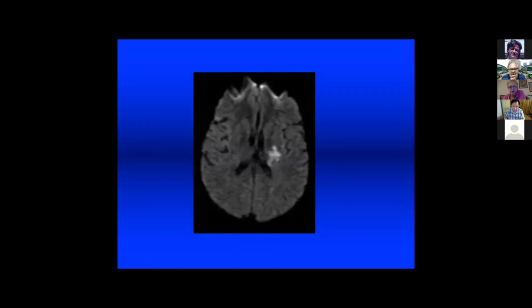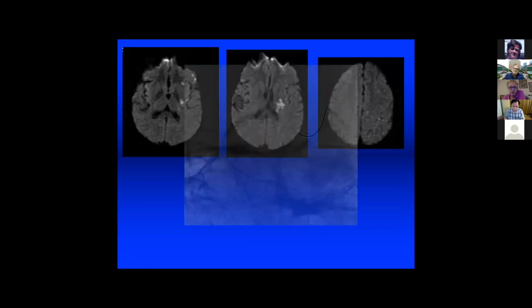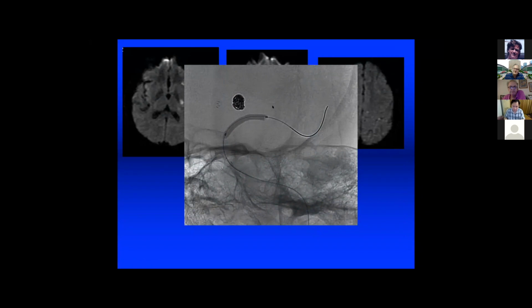But the patient developed paresthesia 6 hours later. The reason is a kinking. I bring the patient another time, a second time to the angio suite, for angioplasty to open the cells to go into this part. I open the cell at this point.